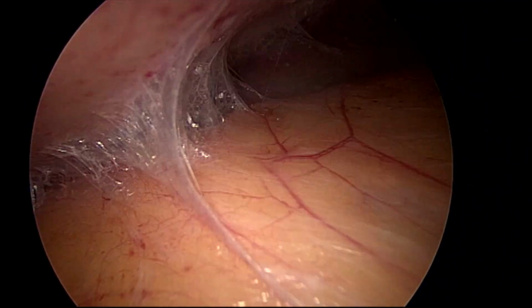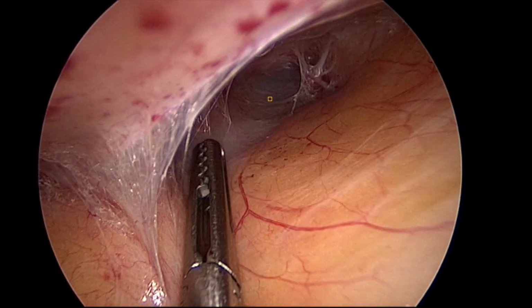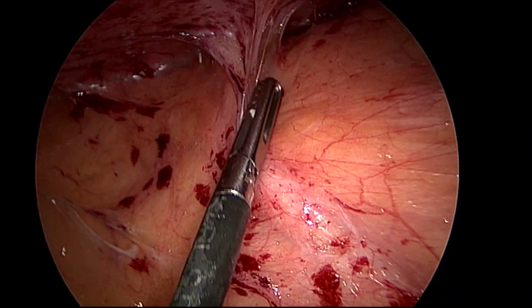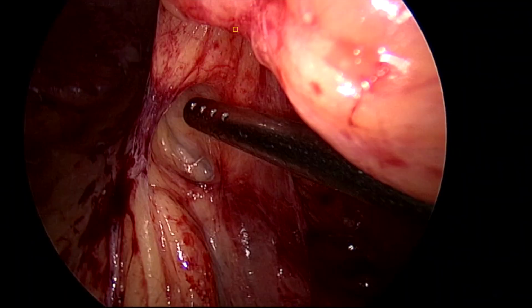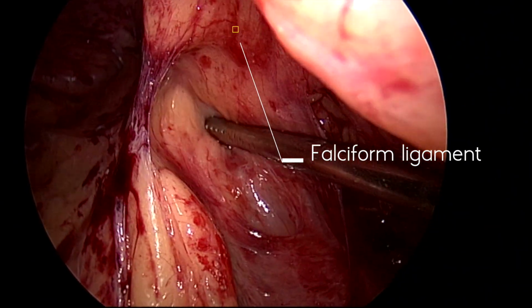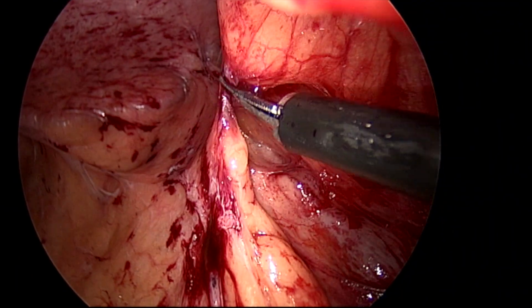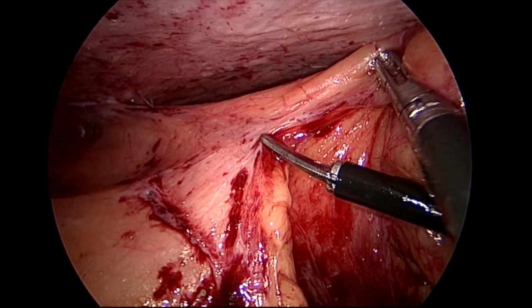So now I am able to see the right lobe of liver. That is the right lobe of liver. I still have to explore the entire right lobe. Then only can I visualize the gallbladder. So I started from the medial side. Now you can see from the falciform ligament I am separating the omentum. So the omentum is separated from the falciform ligament.